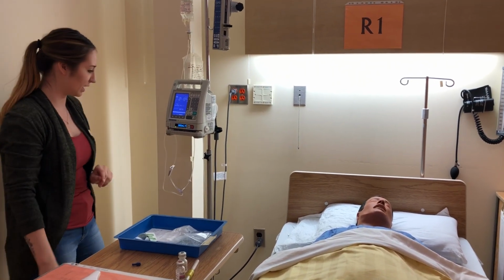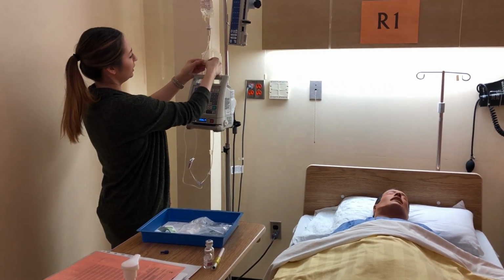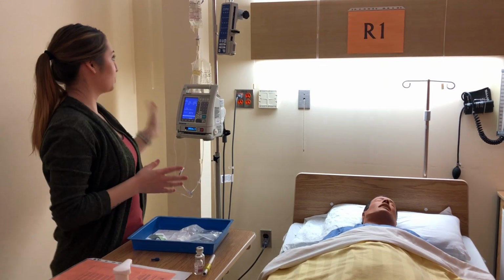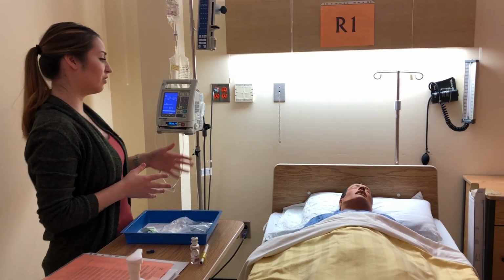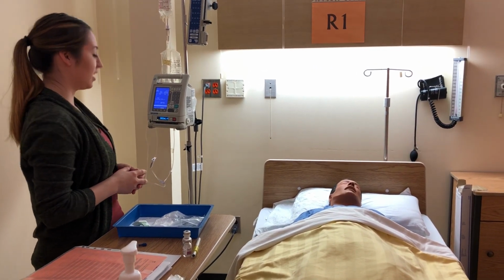I can see the rate, it's running properly. So now that that's all set up, I'm just going to attach my label here so that I know when to change the line. So Emma, your medication is now running. Please let me know if you have any of those adverse symptoms that I was talking about, any nausea or vomiting. We can get that sorted out for you.